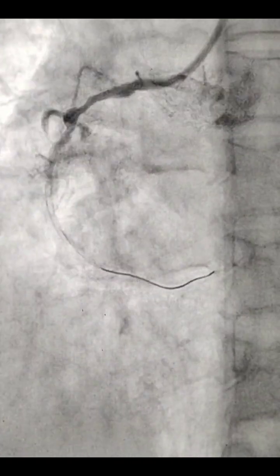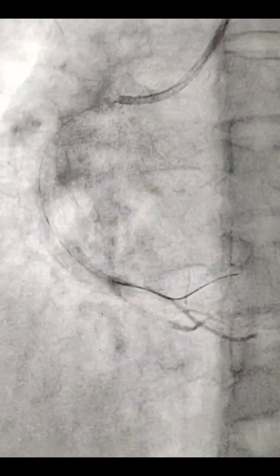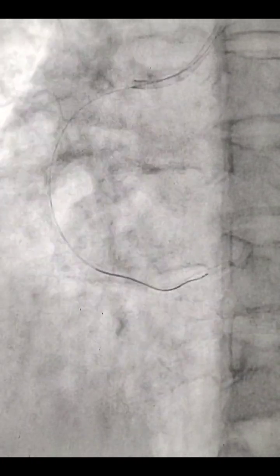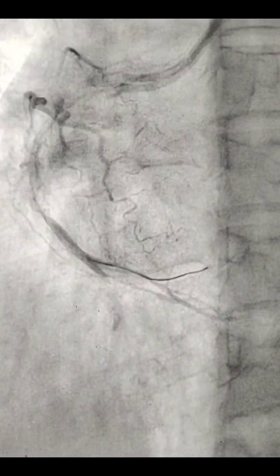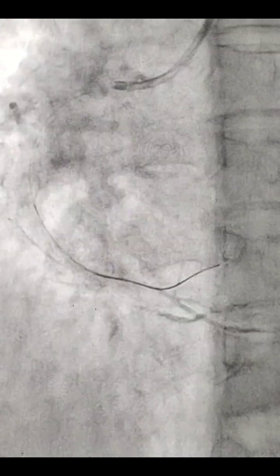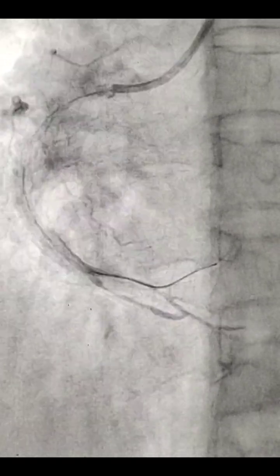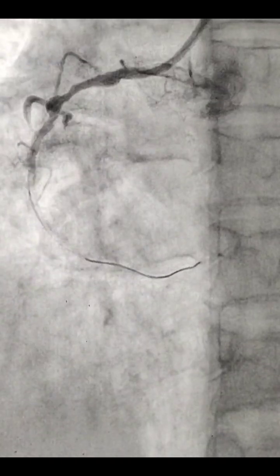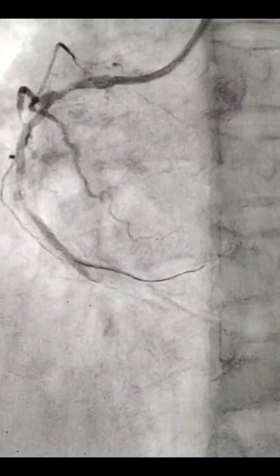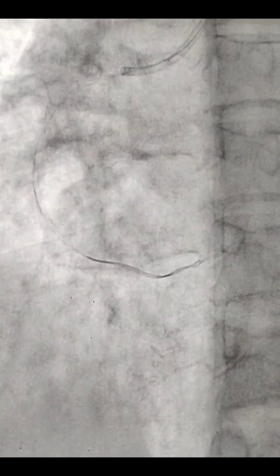So this is the thing. Now I got a flow, but a hard thrombus was there, and it is probably a place of plaque rupture, probably calcified plaque, calcified lesion, fibrotic lesion, thrombotic on top of that. You can see that my wire is a Whisper wire, and my wire is in a very small branch of the RCA. So this is dangerous.